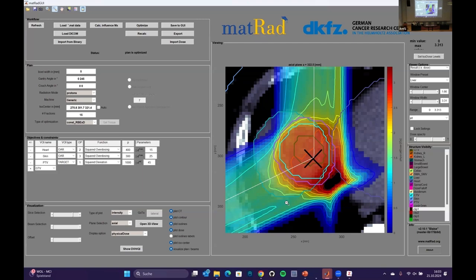You saw this MR Linac; for photons, you can try to integrate an MR. There's also a big project in Heidelberg trying this for protons. There are also other projects in other proton centers and ion therapies trying to do that.